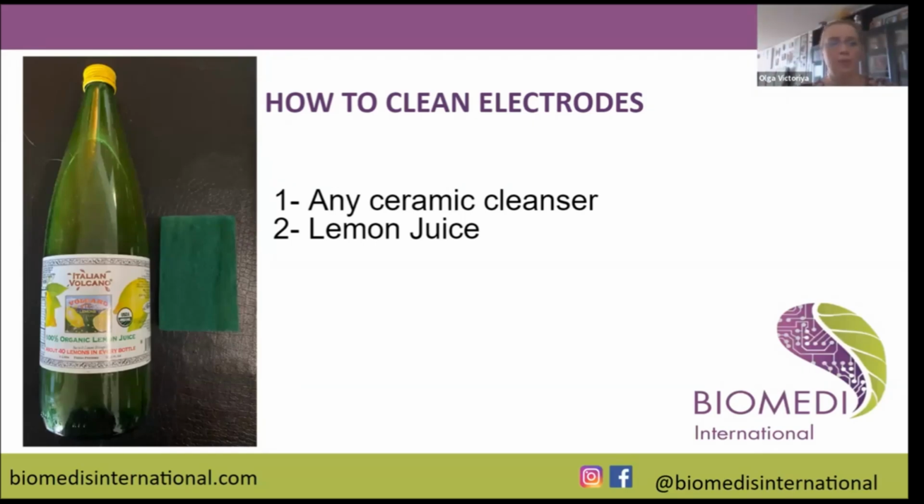Me personally, I prefer to use lemon juice. I buy it at Costco in bulk. It's very cheap. You put a little bit on the electrodes, and I use this surface to scrub it and wash it with water, and they're going to be sparkling clean with all the toxins removed.